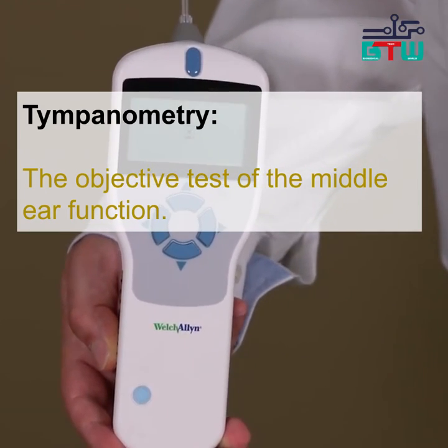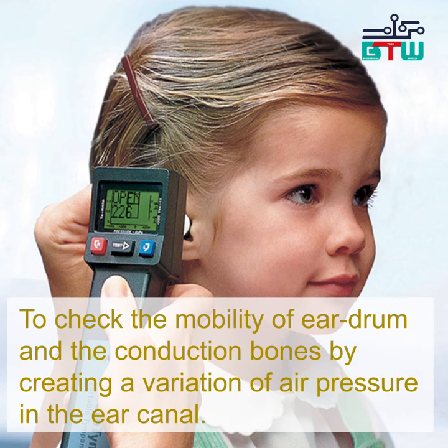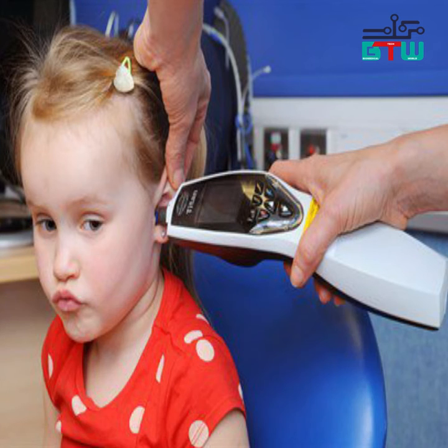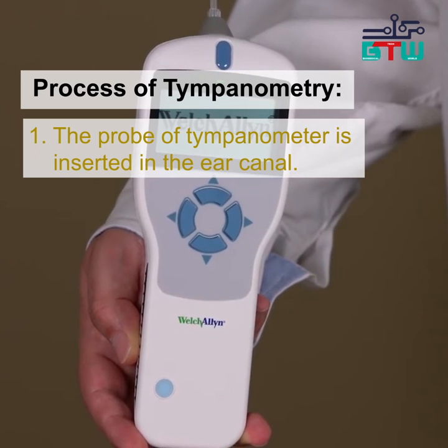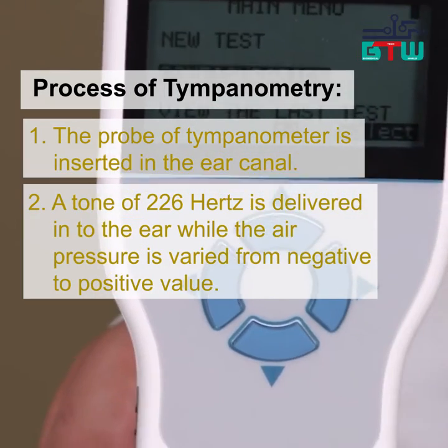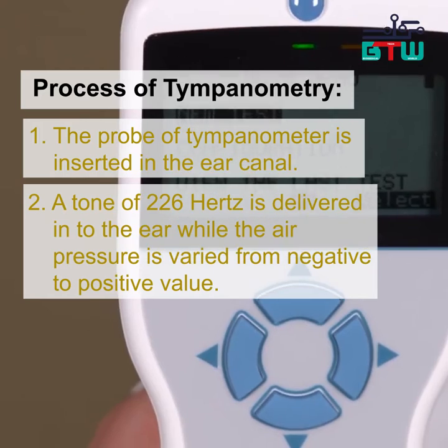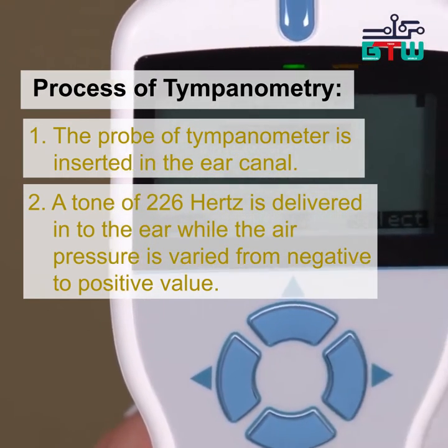Tympanometry is the objective test of the middle ear function. This process is done to check the mobility of the eardrum, and the conduction bones by creating a variation of air pressure in the ear canal. In the process of tympanometry, the probe of the tympanometer is inserted in the ear canal, which contains a loudspeaker, a microphone, and an air pump. A tone of 226 Hz is delivered into the ear, while the air pressure is varied from a negative value to a certain positive value within the sealed canal.